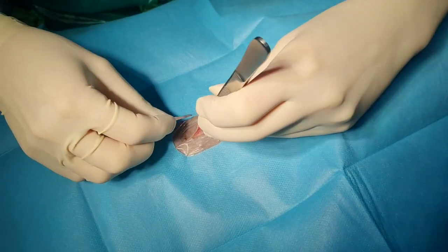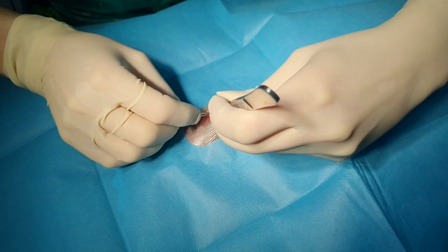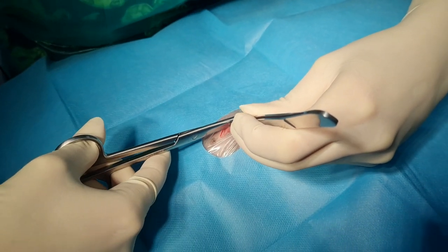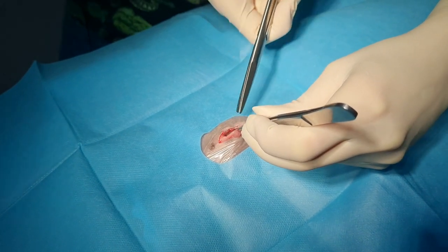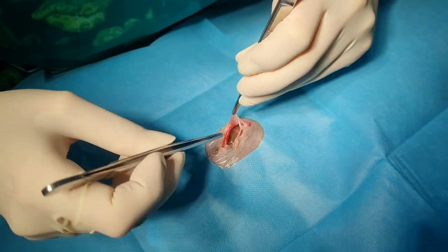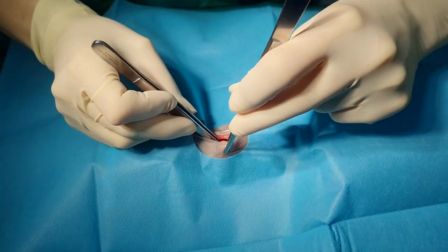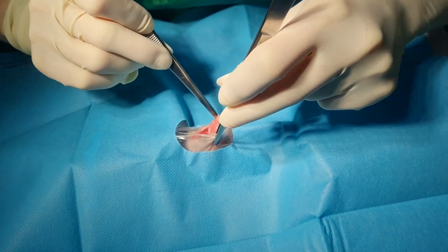Normal routine approach to the abdomen. If this was a younger guinea pig, some people do flank spays or flank ovariectomies. I don't, mainly because I don't often do young females — usually it's the older girls — and I just prefer the access I get this way and I can check for uterine pathology more easily. But if I was doing a younger pig, I would probably go more cranially to avoid touching the cecum. But I know I've got cysts here, so I want to make my exteriorisation a little bit easier.